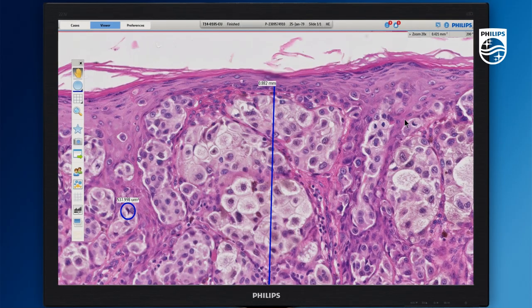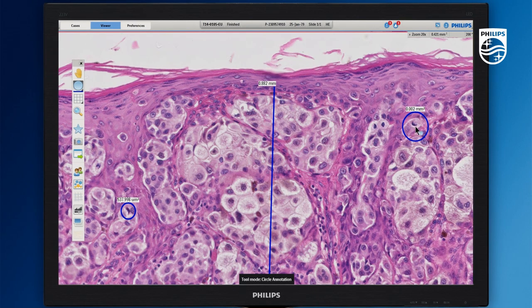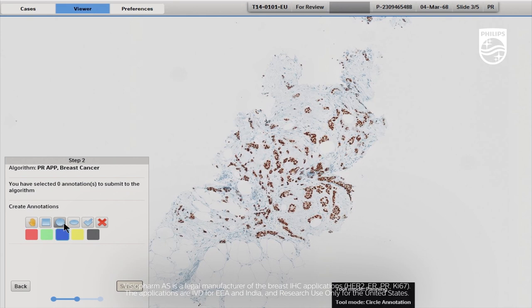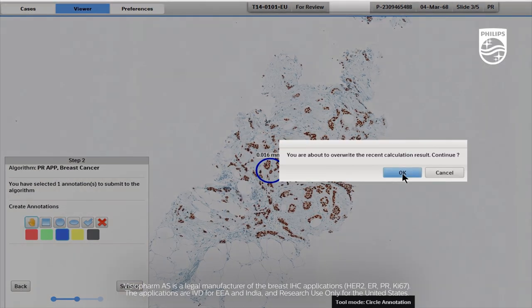The open ecosystem allows enhanced scalability in deployment and opens the pathway to computational pathology, with AI-based algorithms helping to boost efficiency and provide new insights that empower you in your decision-making.